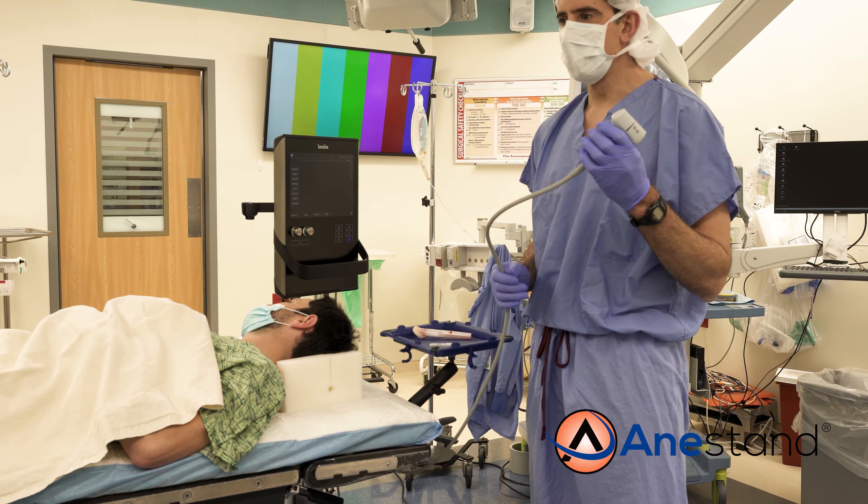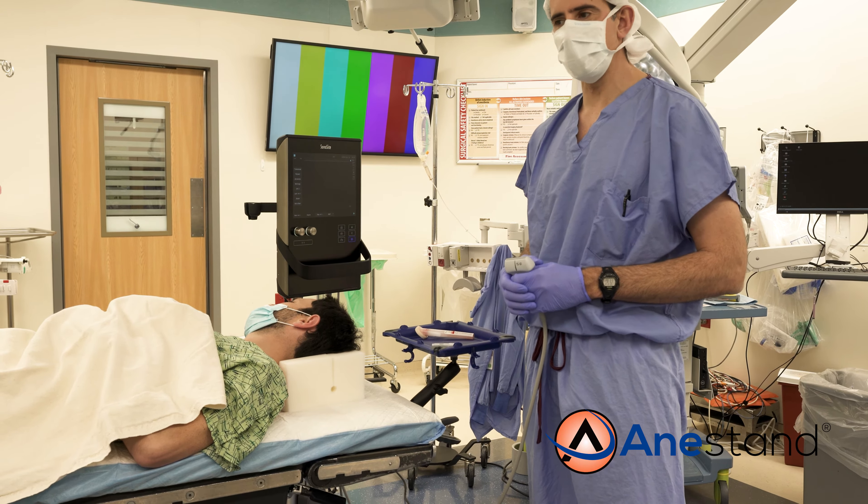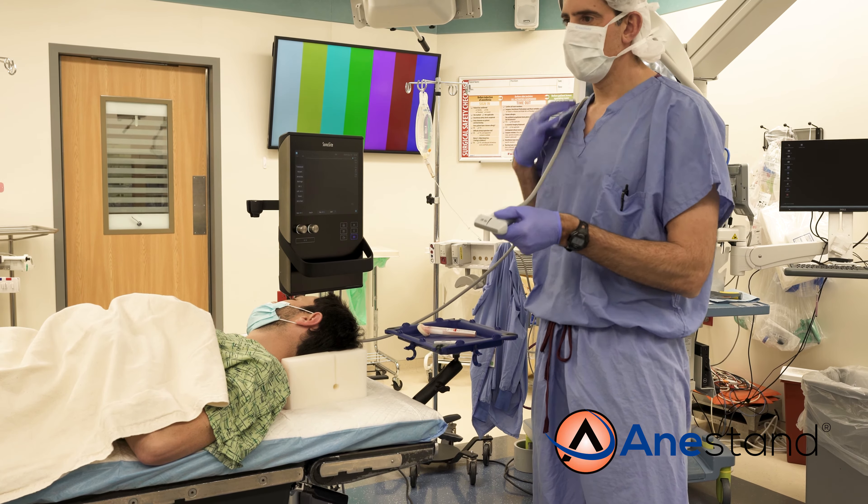The majority of these blocks are now done under ultrasound guidance. There are times when, during your block, the heft of the cord can make holding the position that gives the best view difficult. Previously, to deal with this, providers would use a variety of techniques to mitigate the pull of the cord.